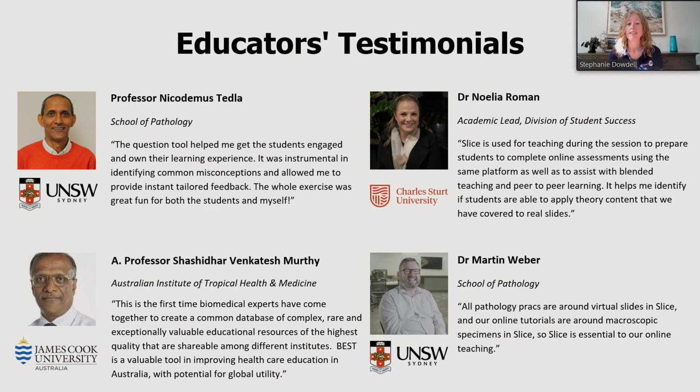One of the key features of Slice and our community is the ability to draw from the teaching collections of other institutions to provide students with the best possible examples for teaching. Dr. Martin Weber from UNSW was responsible for a lot of the pathology teaching for students completing their medical studies at rural campuses at UNSW. Without Slice, it would have been impossible to run these tutorials around macroscopic pathology specimens that had been photographed and placed on Slice, as well as the virtual slide collection, which gives both local and remote students equitable access to resources.